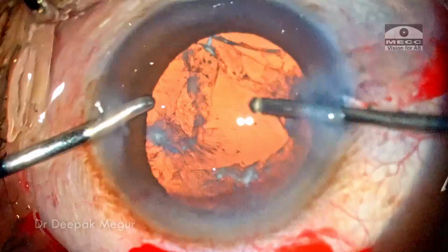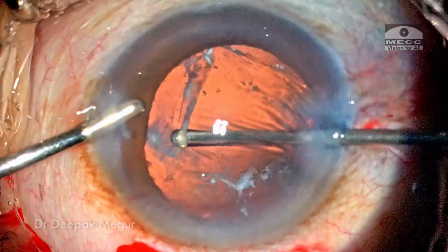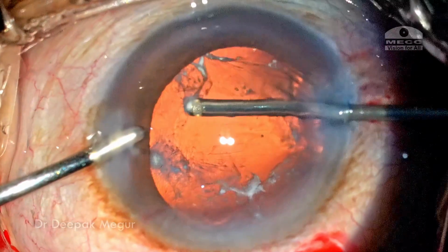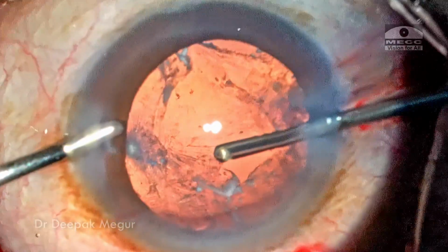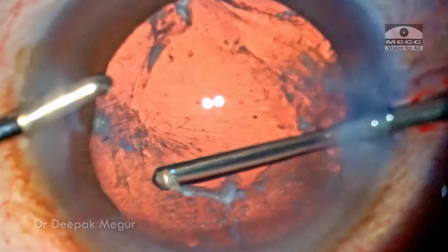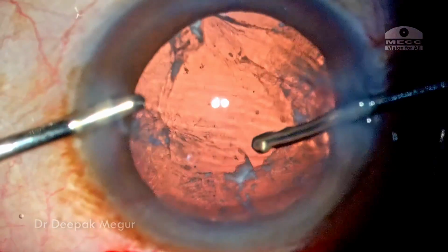Now is the time to enlarge the anterior capsular opening, and I'm going to use the vitrector itself to nibble at the anterior capsule and enlarge it. So I'm going to use the IA cut mode, that's irrigation, aspiration and cut mode, just to engage this anterior capsular flap and then keep nibbling at it so that eventually I have a decent sized opening.